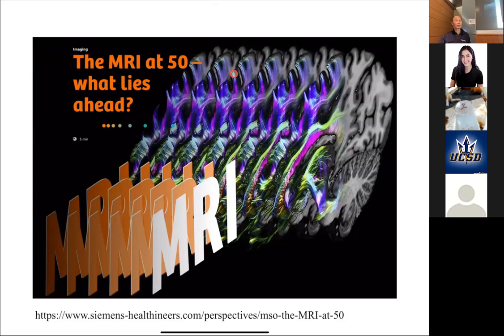Yes. What happens if someone's moving in the MRI machine too much when they're taking the data? Yeah, that's a big problem. So typically, like for babies, you might anesthetize them, right? Or if there's a severe case, you would anesthetize a person, but that's obviously quite extreme, right?